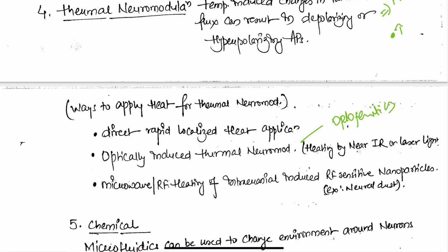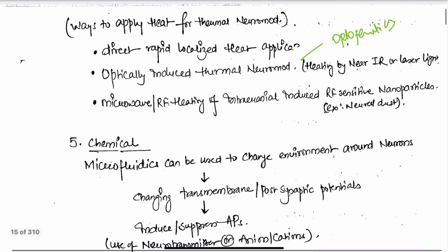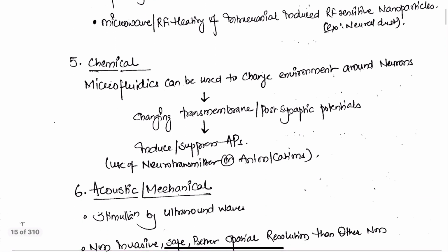And then you have microwave RF heating systems, where intracranially induced nanoparticles called neural dust are used, and they help in heating.